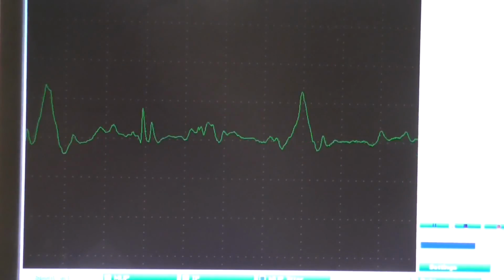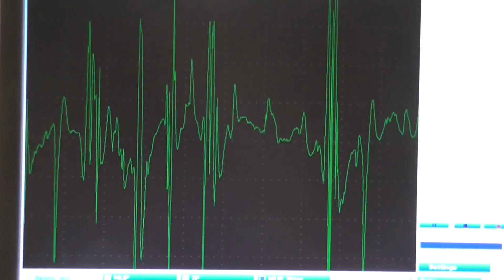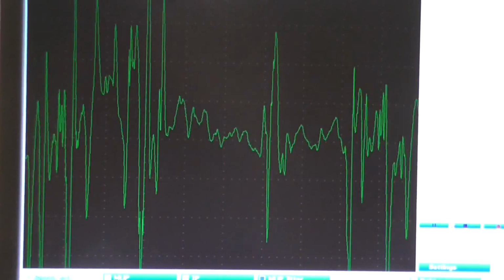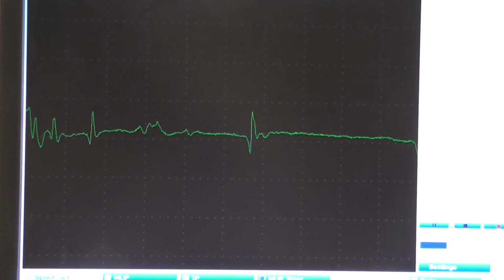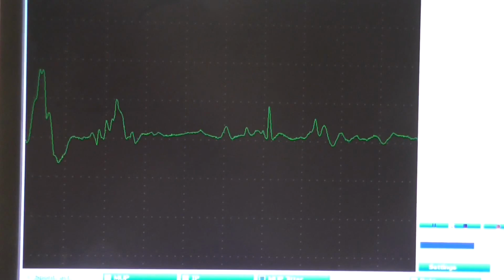Here the patient is barely activating their muscles, we're having small units, they sound very scratchy, they're coming in very rapidly. These are very typical findings for a myopathy.